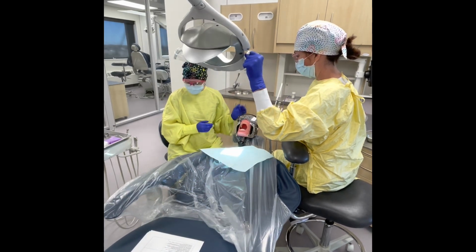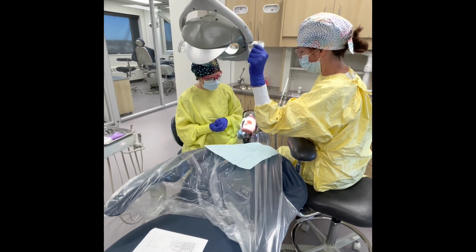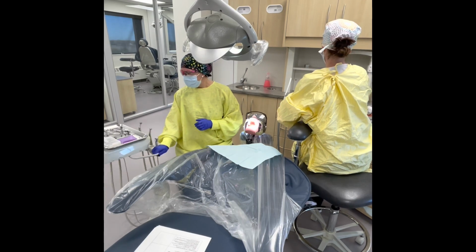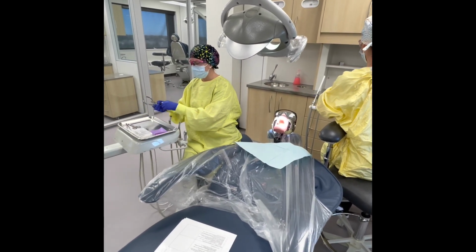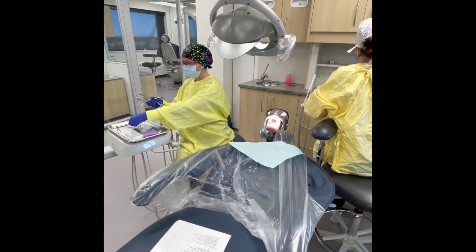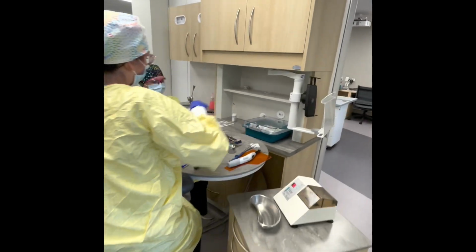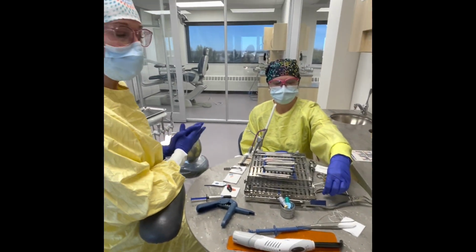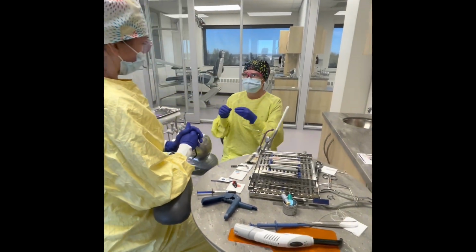Okay, so I know Stacey went over the pre-op instructions with you for today. Do you have any questions at all before we begin? No? All right. So the first thing I'm going to do as the operator is take my dental dam armamentarium and put it over on the assisted side here. This will give you time to practice doing four-handed dentistry with putting dental dam on.